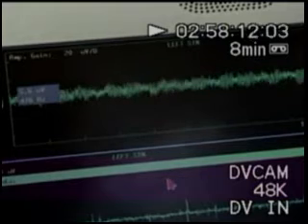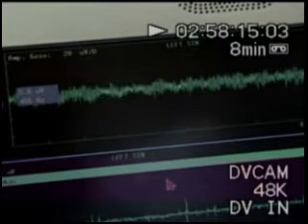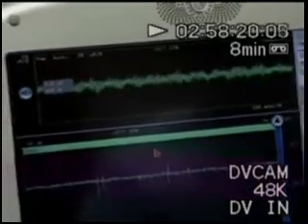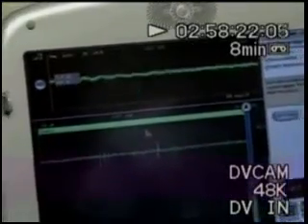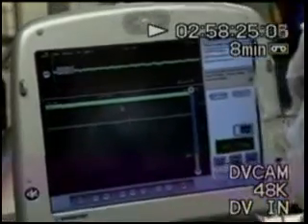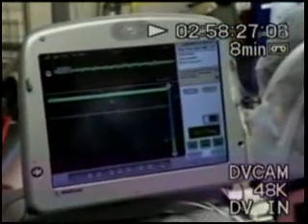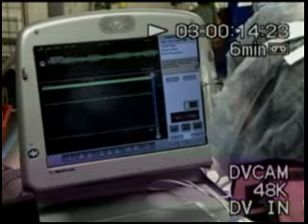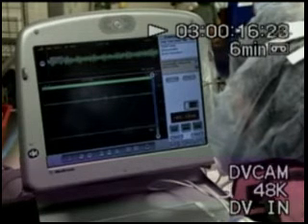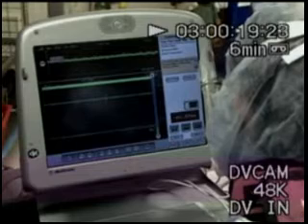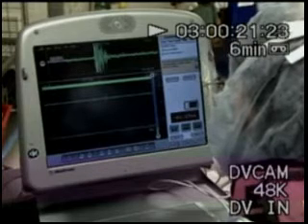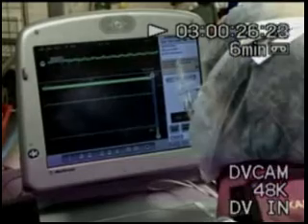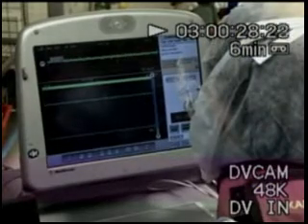That green wavy line you see — these are brain cells sending electricity to my computer. We slowly go down while we keep looking at those lines and listening to the sounds they make to try to identify the correct part of the brain. On the bottom right corner, there is a number that identifies the distance we are away from the original target.